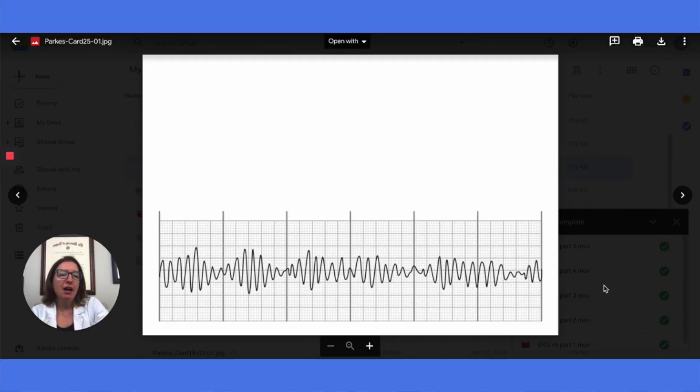In this rhythm, we have something called torsades de pointes, which I hope I'm saying right. I might be butchering it because it's definitely not above me to butcher a name. When we look at this strip, this doesn't look anything like a normal EKG strip. We don't have nice little P waves and QRS complexes.